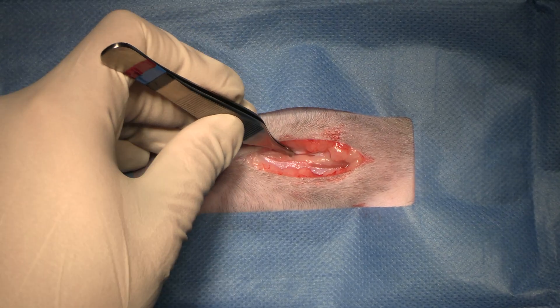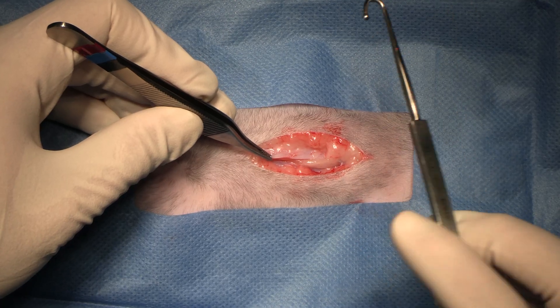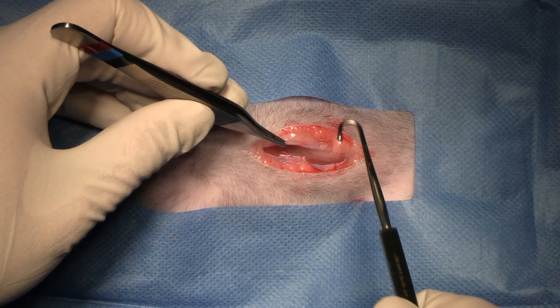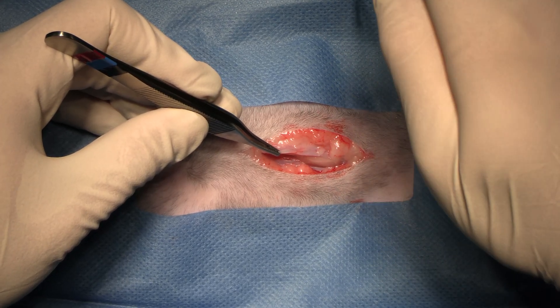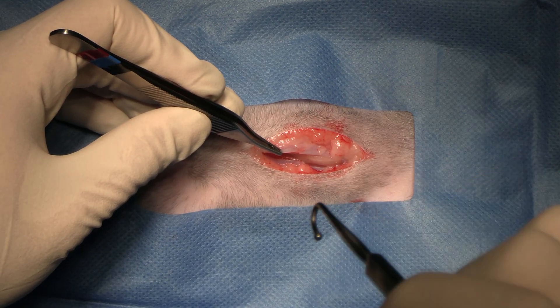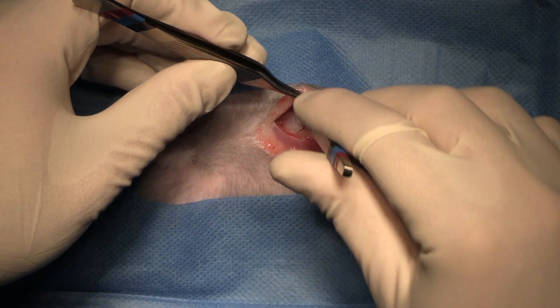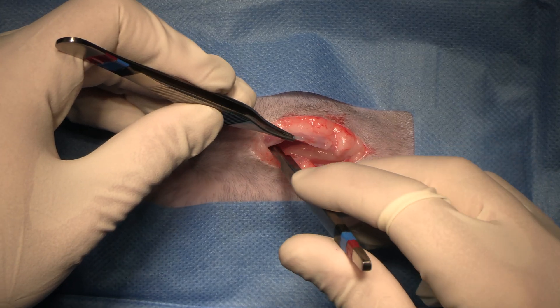Find our uterus spay hook — as always facing cranial-caudal, going along the body wall until you hit the dorsum, turn it towards the midline, march it towards the midline, come up. Along the body wall to the dorsum, turn it towards the middle, march it slowly towards the midline.